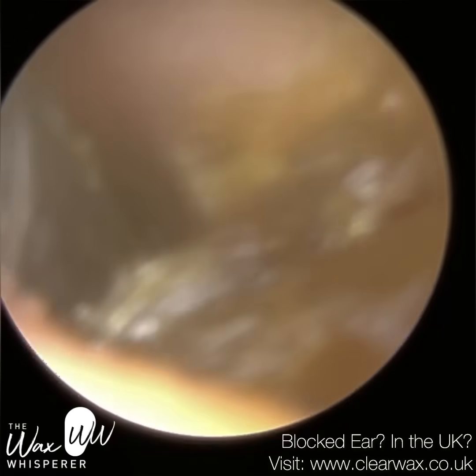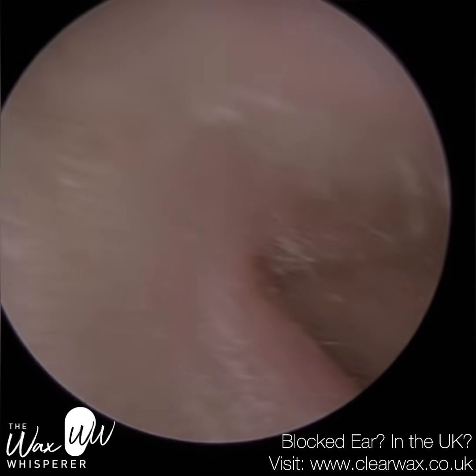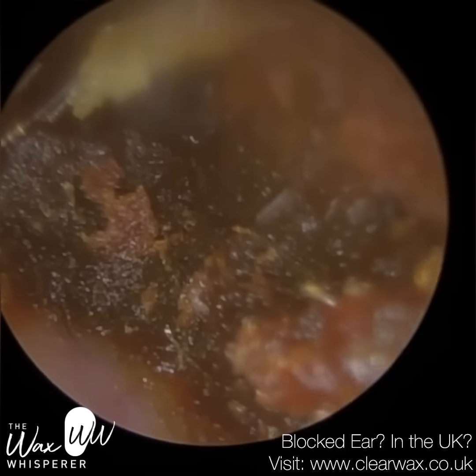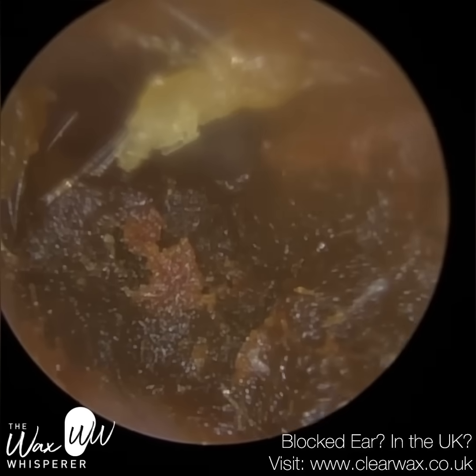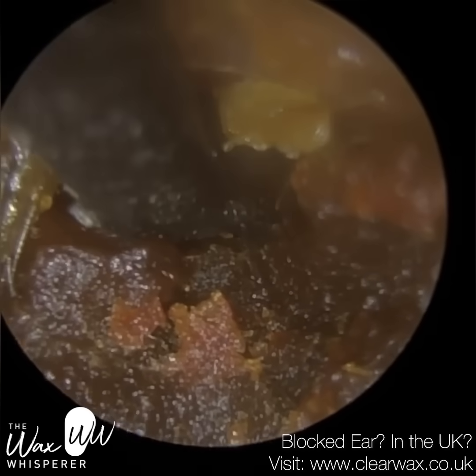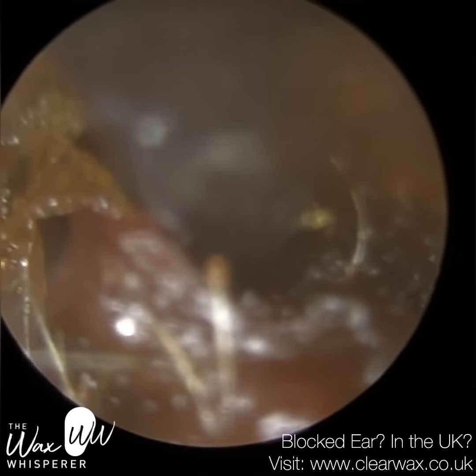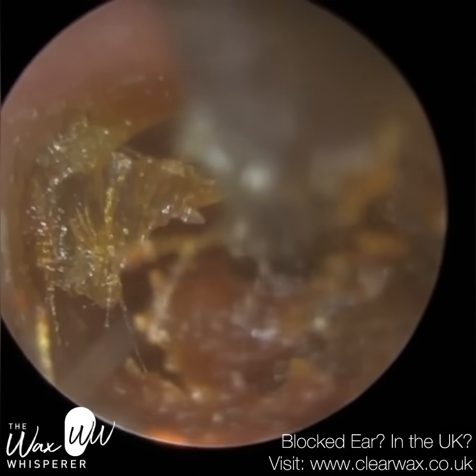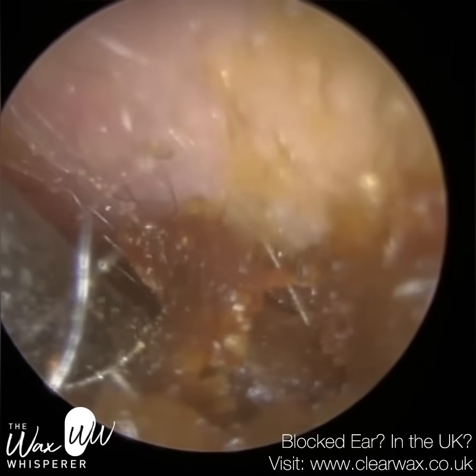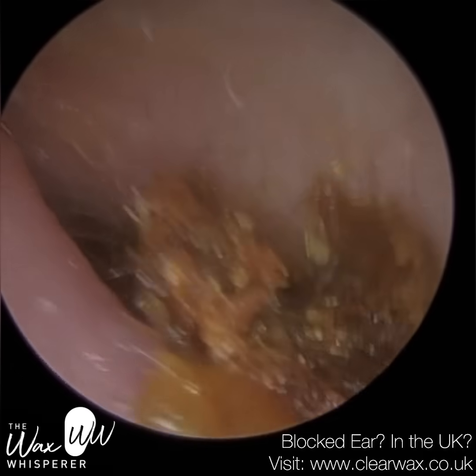If you've got deep earwax and I'm right-handed, so I'm holding the Rykerette in my right hand — if you've got earwax deep in the ear and it's on the right-hand side in particular, what can happen with a straight instrument is that as you're entering the ear and leaning over towards the right, the hand holding the instrument can actually cross over and obstruct your line of view, which is obviously not ideal because you can't really see what you're doing inside the ear. So with the bent version, your hand never needs to obstruct your line of view, because it's always out of the way — and that's a major, major benefit.